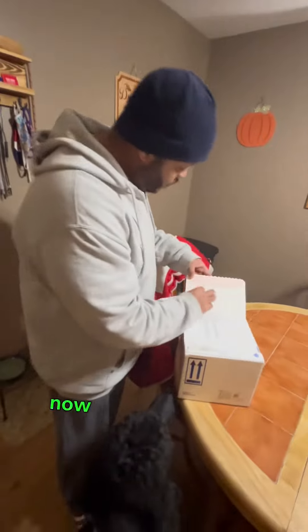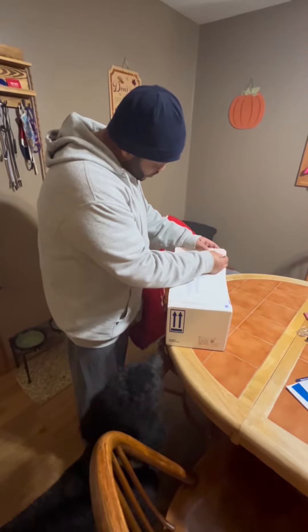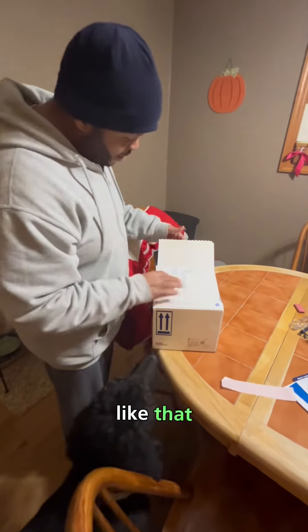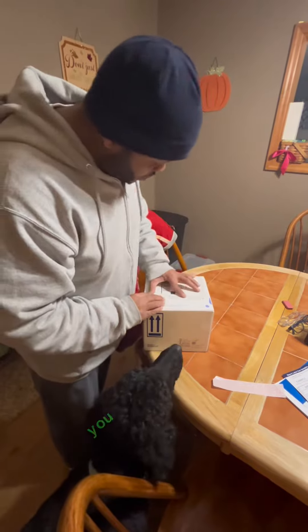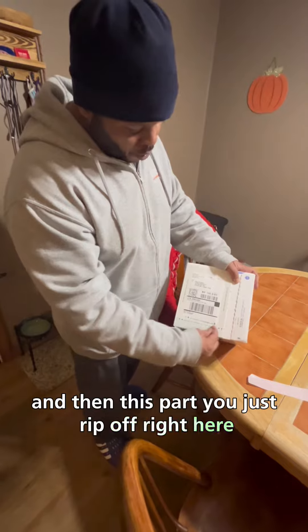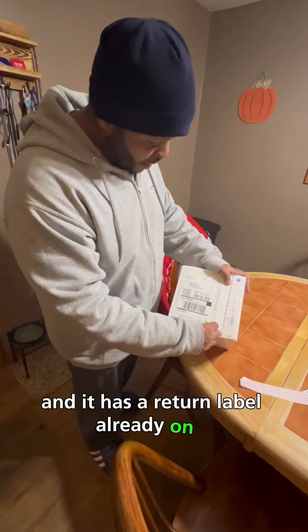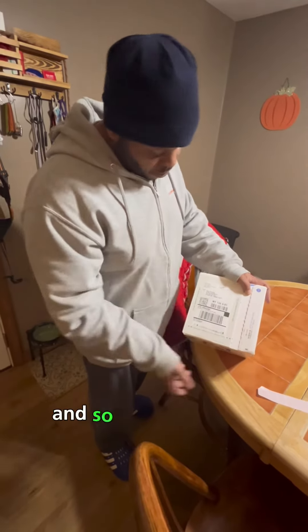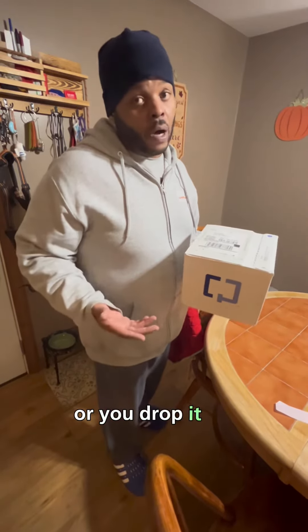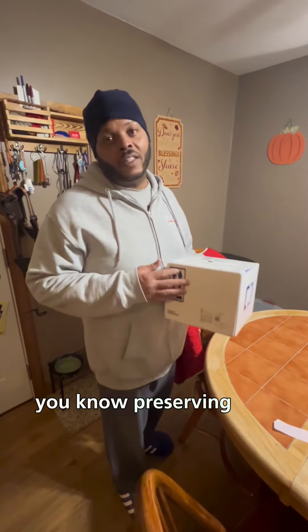It's all sealed up now. We take this part right here, like that, and you seal it shut. Then there's this part you rip off, you lift this up, and it has the return — already on it. So what you do is you either call UPS and have them come pick it up, or you can drop it off. I'm going to drop it off tomorrow, so it'll be sitting in my car preserving the dookie.